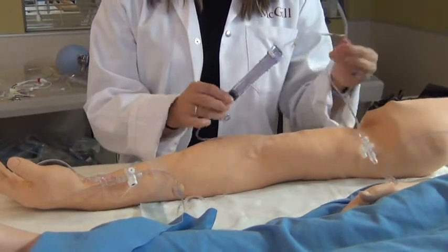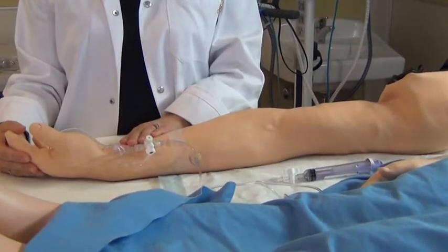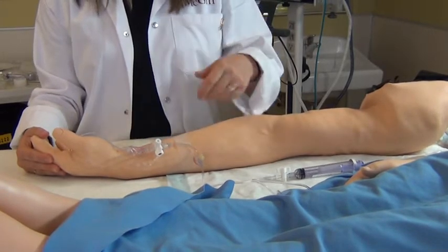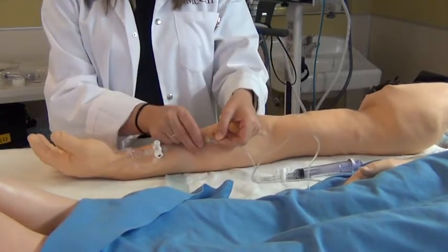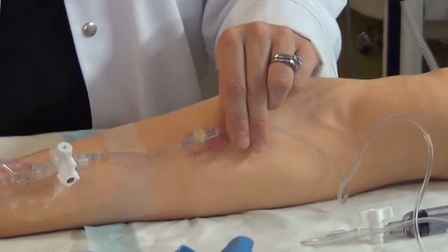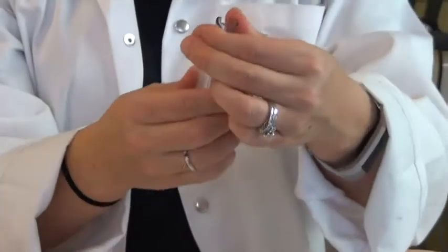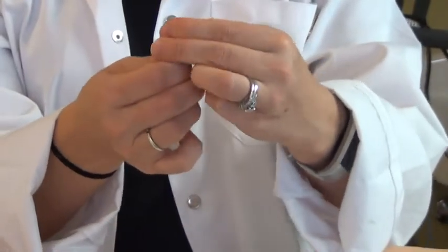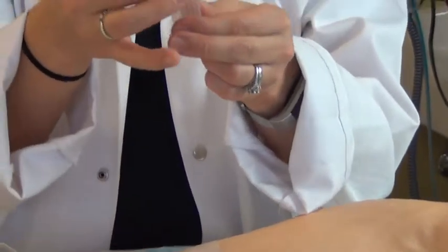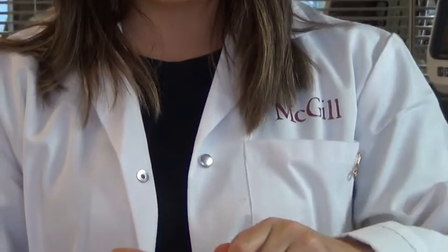Also, it preserves sterility. So, how do we take blood out of an arterial line? Because this is one of the very useful things that we can do with it, other than measuring arterial pressures. We will use the safe set syringe, and you will see the port from which we can withdraw the blood. The port can be accessed via a special luer lock, which is already attached here. It is a separate attachment for our syringe. So when you are putting together your set, you will need to go get the special piece to be able to access the safe set.